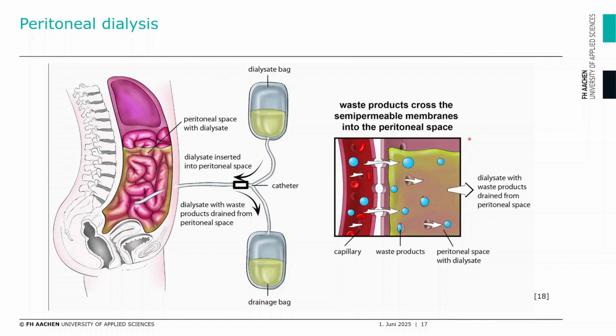During peritoneal dialysis, a sterile dialysis solution is introduced into the abdominal cavity. This solution acts as a dialysis fluid. According to physico-chemical principles like concentration gradient, molecular size, and electrical charge, dialysable substances migrate from the blood vessels of the peritoneum into the dialysis fluid in the abdominal cavity or vice versa. This takes place until the concentration gradient is equalized. This mainly occurs through diffusive substance transport. Larger molecules are also transported convectively.